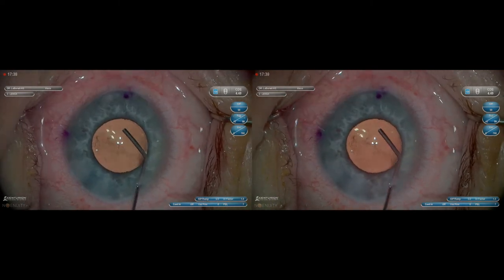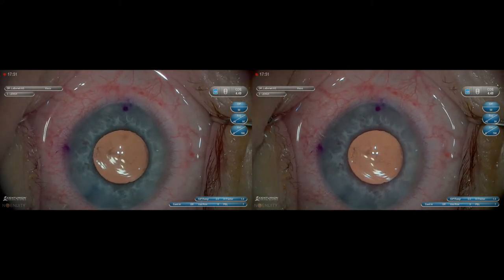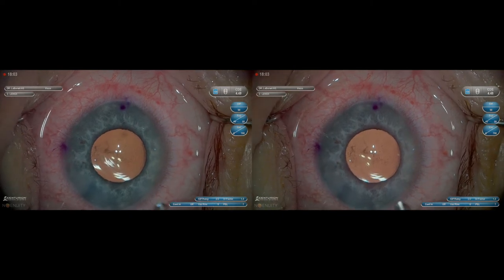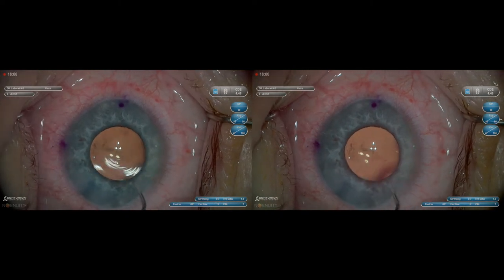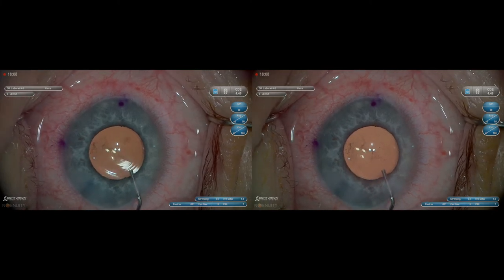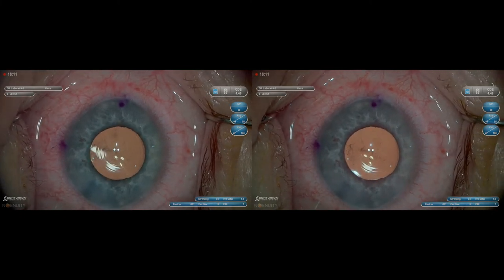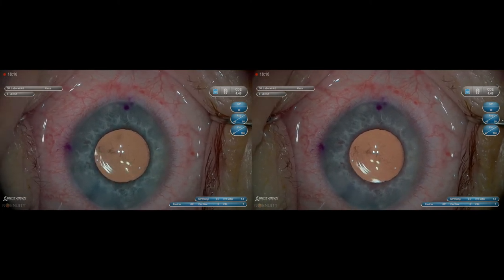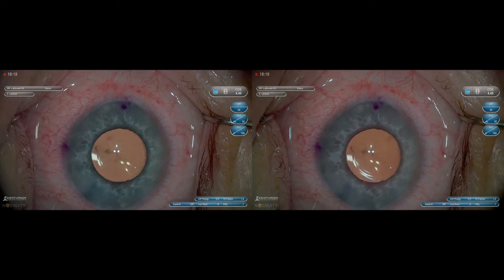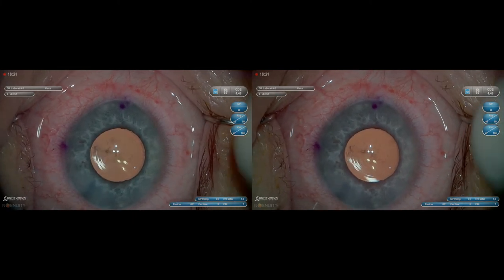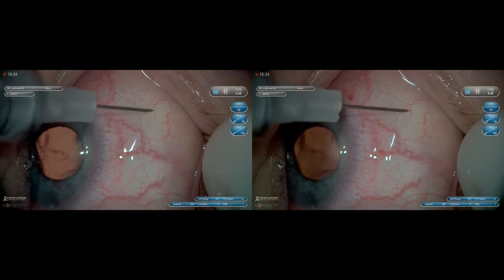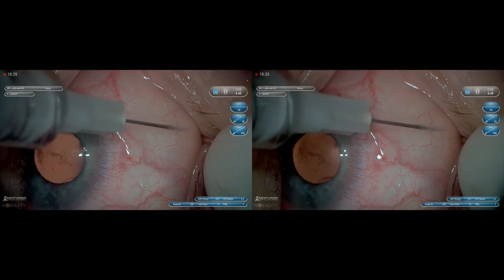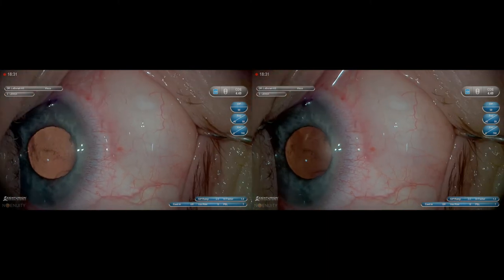I sped the video up to show hydration of the primary and secondary wound, confirming it's watertight and sealed. Next is placement of anterior chamber Moxifloxacin. And then since I do drop-free cataract surgery, I place 0.15 cc's of Kenalog 8mm supranasal to the limbus. I move the needle back and forth to confirm I'm not in the rectus muscle before placing the medication.